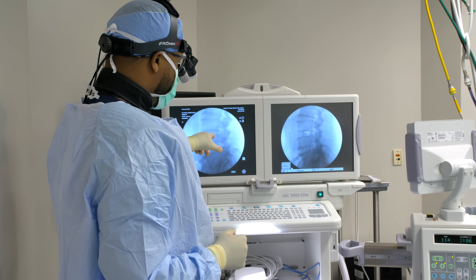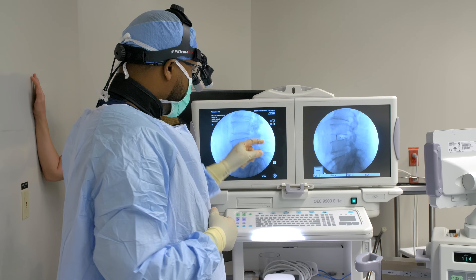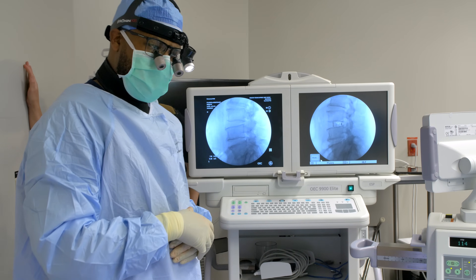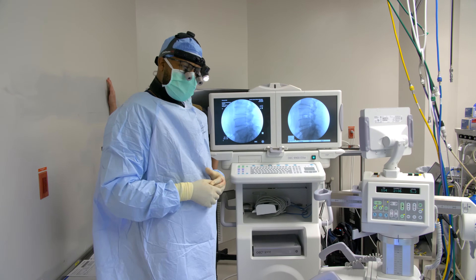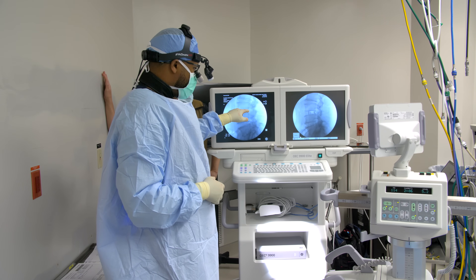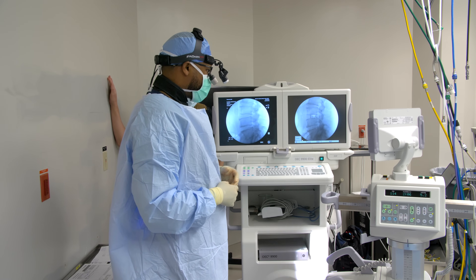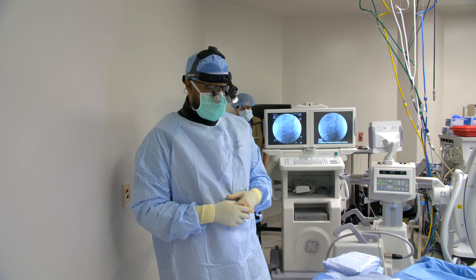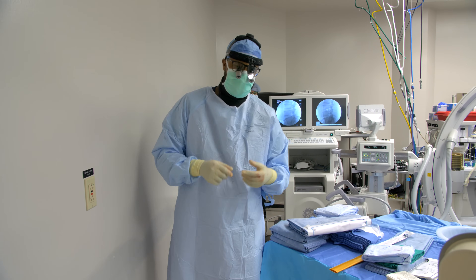Before surgery this patient had retrolisthesis, meaning his vertebral body had slid backwards. You can see how small the nerve hole was before, but with the cage in place, look how much bigger that foramen is — foraminal height distraction. This addresses foraminal stenosis, where the posterior bone was encroaching on the foramen, causing significant leg and back pain. We've indirectly decompressed the neural elements with the large cage. Now we flip the patient to place percutaneous screws.